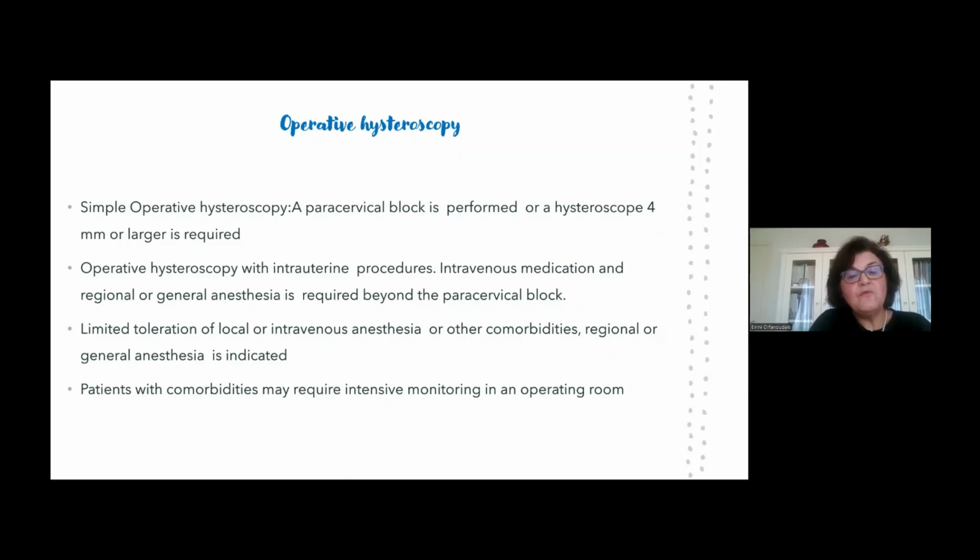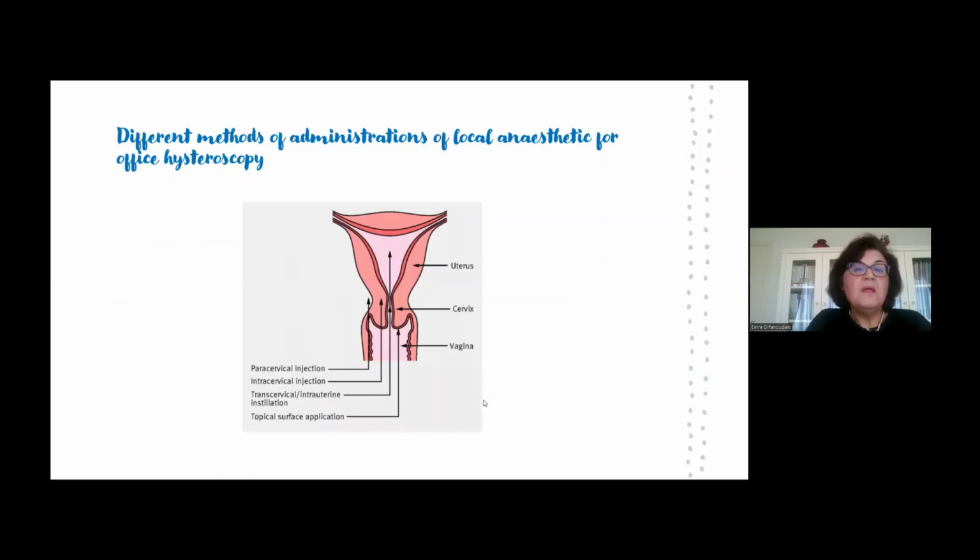With limited toleration of local or intravenous anesthesia or other comorbidities, regional and general anesthesia is required. Patients with comorbidities may require intensive monitoring in the operating room.